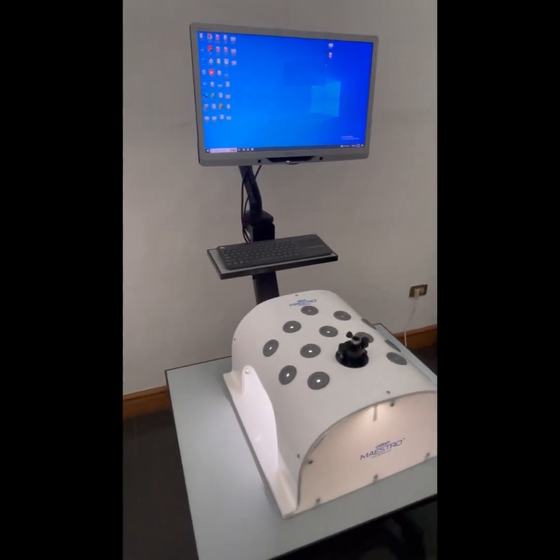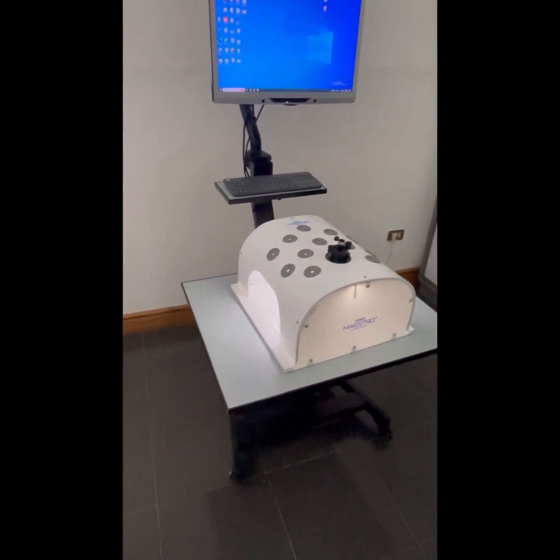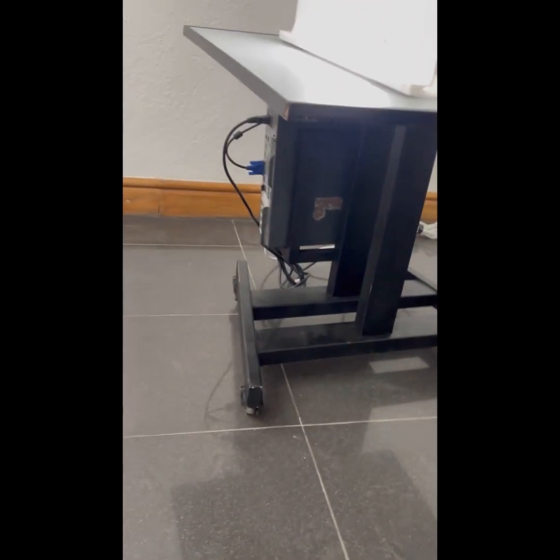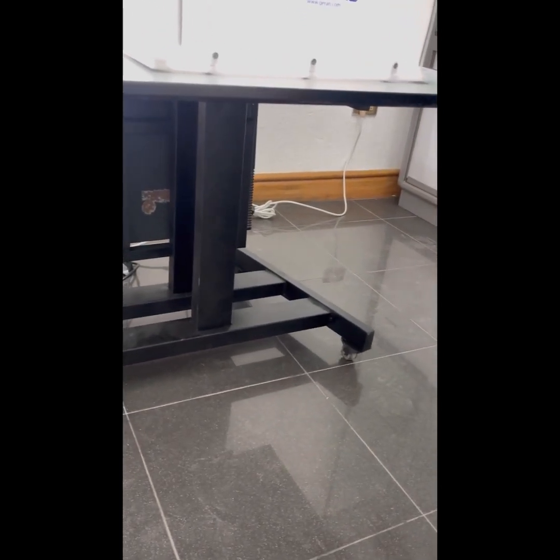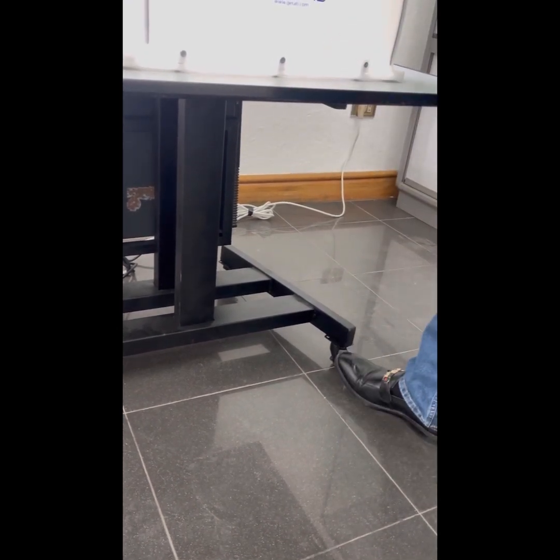We have this trolley system. The trolley has wheels so it can easily be moved to any particular position, and it has brakes. Once you switch on the brakes, it will hold its position.